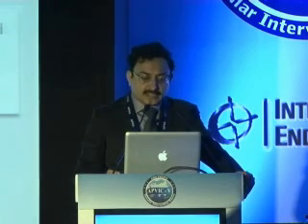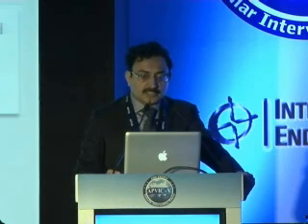Now once we start, we do an Allen's test and look at the size of the radial artery. The radial artery has to be at least 2 millimeter in diameter to be able to take up a 6 French sheath, and these are the arteries which are then suitable for doing a peripheral vascular intervention. And we always check the Allen's test for the continuity of the palmar arch, so that even if the radial artery accidentally gets into a problem, the ulnar artery takes care of the supply to the hand.